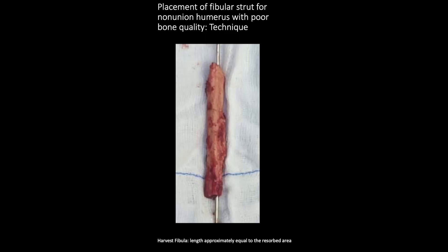Hello friends, this is a short video regarding how to place the intramedullary fibular strut graft in approaching the non-union shaft humerus.